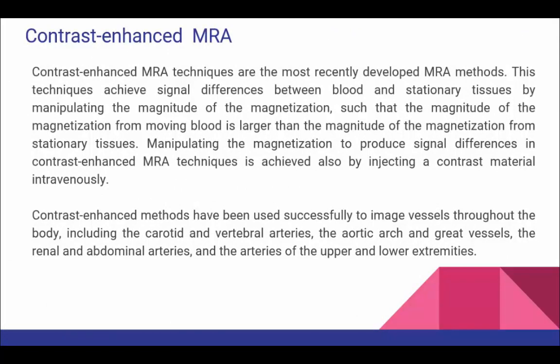Contrast-enhanced MRA techniques are the most recently developed MRA method. They are probably the easiest to understand of the three classes of MRA techniques, and when implemented properly, they provide diagnostic quality images under very diverse conditions.